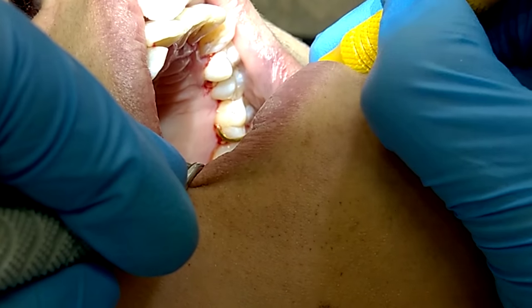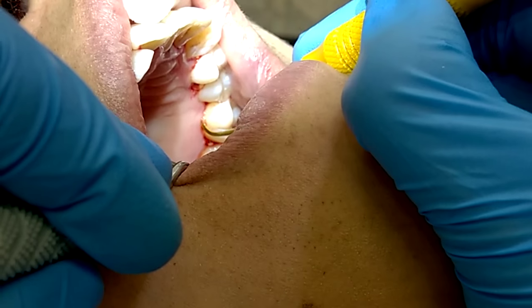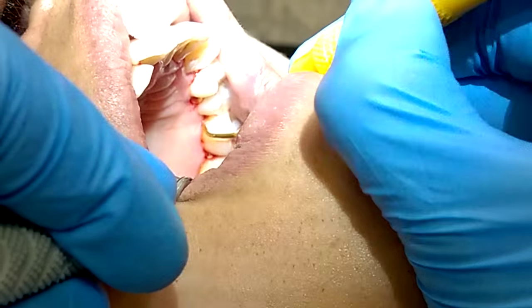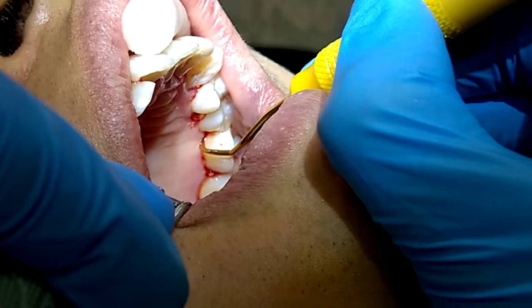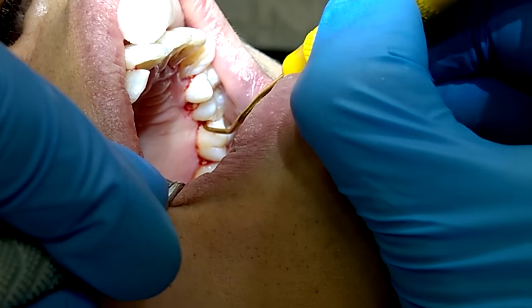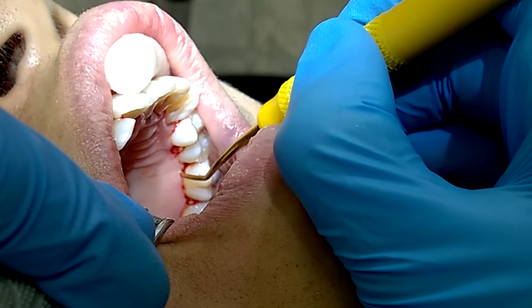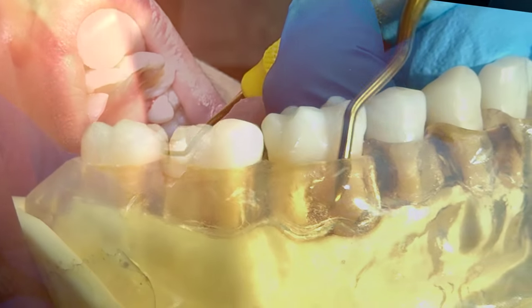XP technology also allows the blade to be very sharp and very thin, which increases tactile sensitivity. You don't sharpen instruments made with XP technology, which removes the need for those mid-procedure sharpening breaks. These characteristics make it a very effective and efficient instrument.